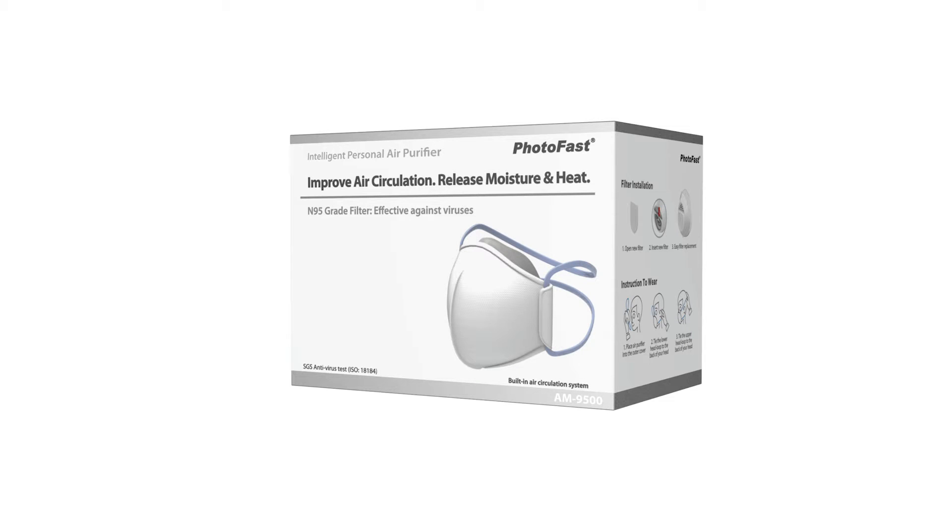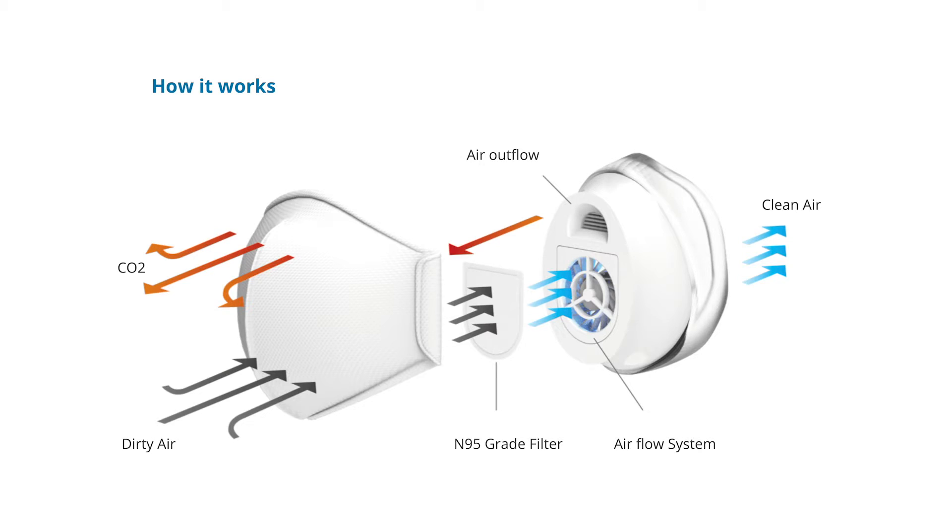The first mask we're going to talk about today is the Photofast AM9500 Intelligent Air Purifier. Right out of the box, this mask is a little bit different than the others because it has a fan right on the front of it. In theory, you shouldn't have to work as hard to breathe while wearing this mask. However, I will point out this mask is not a respirator.